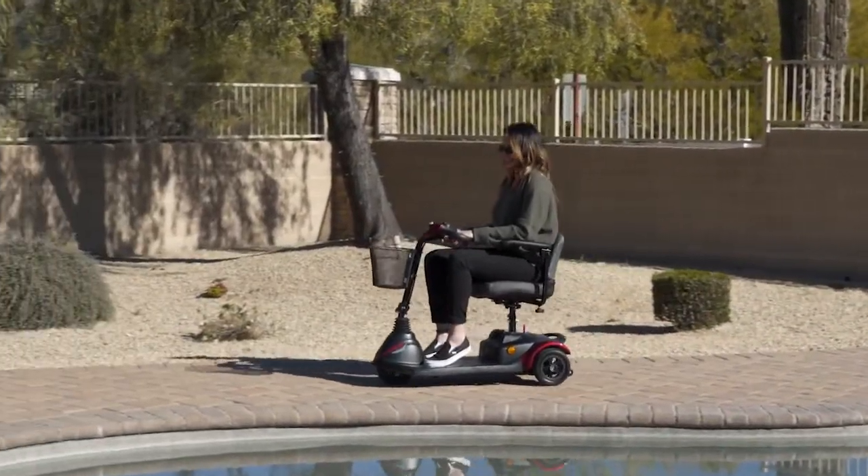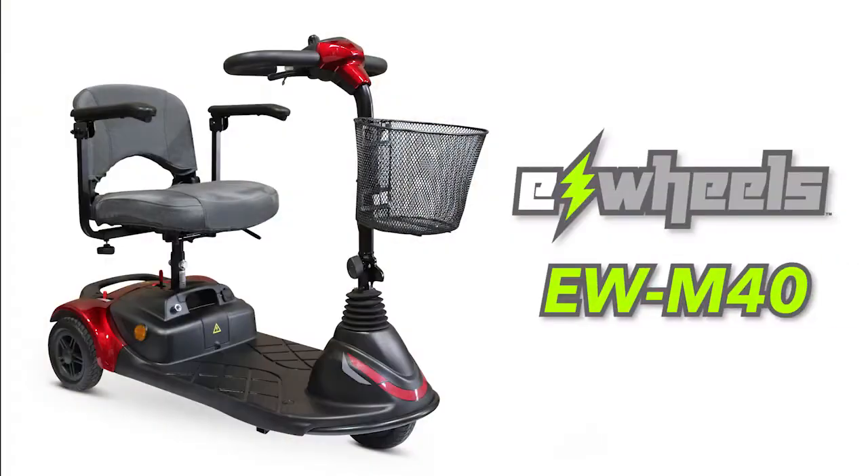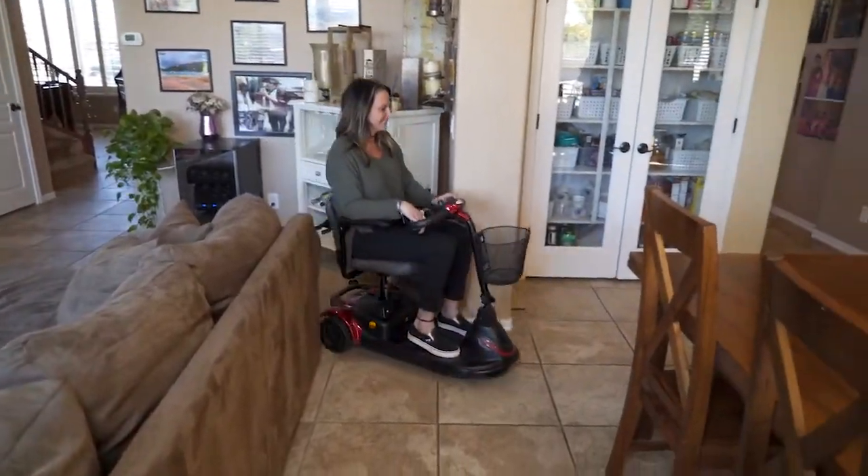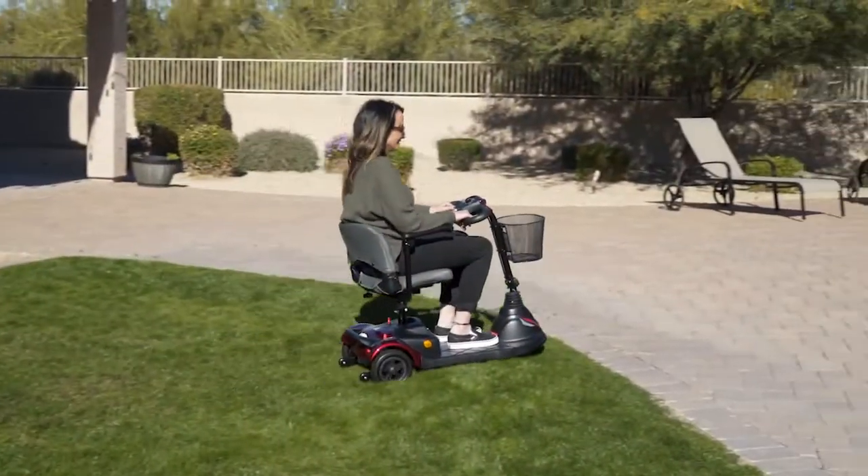There's no need to give up your active lifestyle when you have the E-Wheels EWM40 Medical Scooter to get you around. Lightweight and transportable, the EWM40 is easy to drive and is highly maneuverable, whether you're indoors or enjoying some time outside.